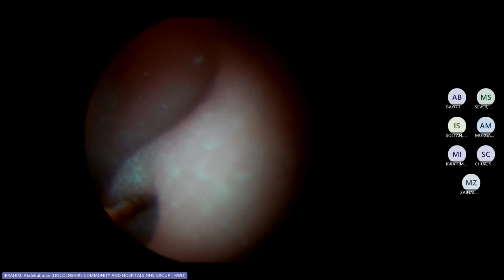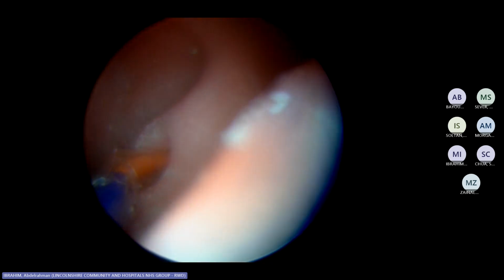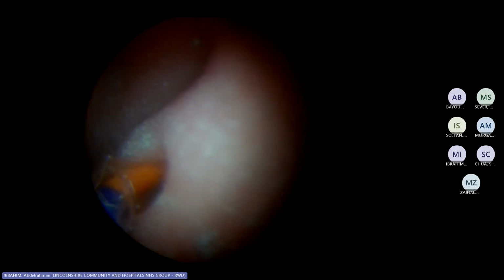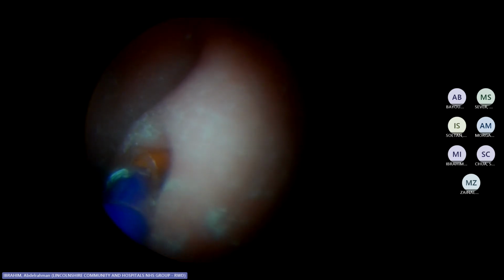So now Salam just pushes the balloon in. And you want to make sure that you go to the 2 lines, which marks 2 centimeters. Once you've advanced, I will just put this in. We can get the connection anyway, hopefully once the water comes out. You still push to the end.